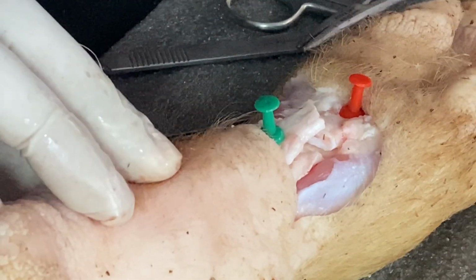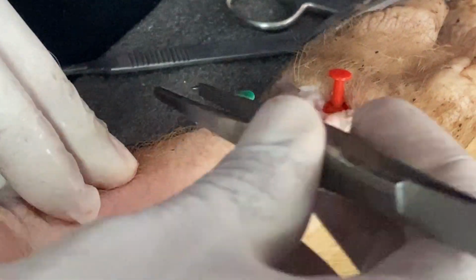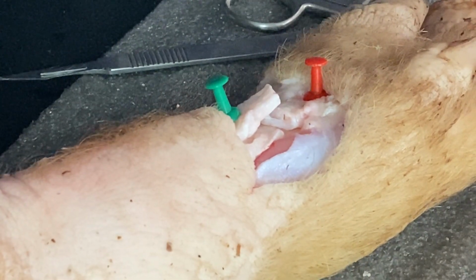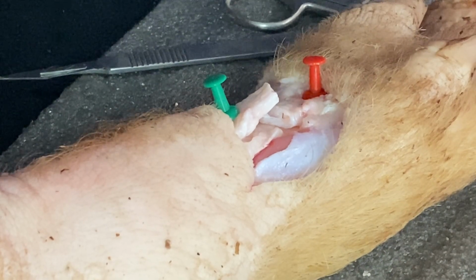What do you mean by exploration? This is not actually the exploration. Exploration is the thing when you don't find the proximal end of the tendon, then you need to go towards the tendon. You need to go towards the site of origin of the muscle.